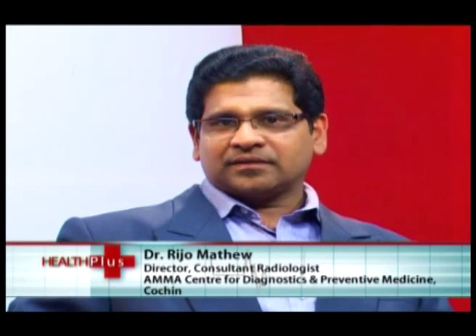So, Dr. Rijo, would the baby actually come to know that he or she is being watched by her mother during a 4D scan? Yeah, that's an interesting question. See, when we do the 4D scan, of course, there is a little bit of mechanical pressure from the probe side. We have done a series of studies, especially to assess the feto-maternal bonding.